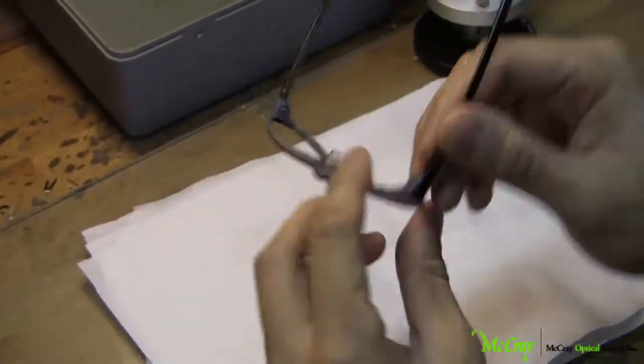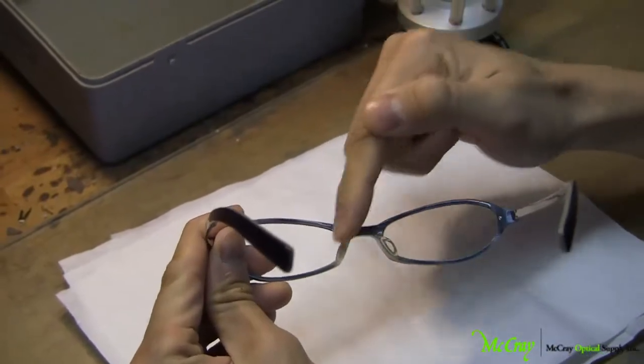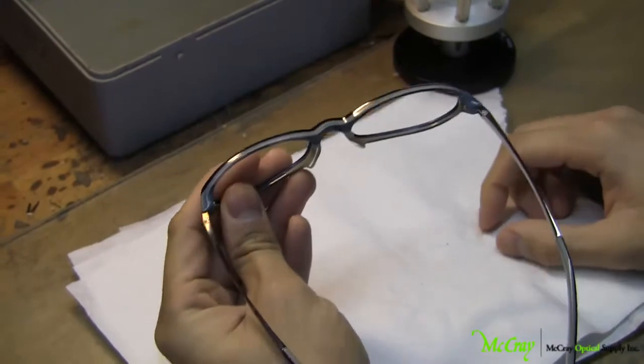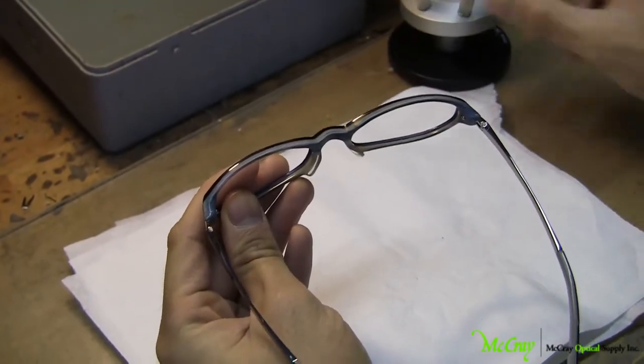The frame today that we've chosen, as you can see, has two points that are quite large, and this is just for nose support. First thing we have to do is to remove the actual temples first.